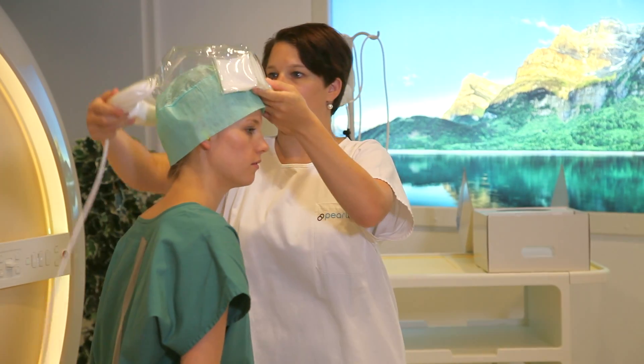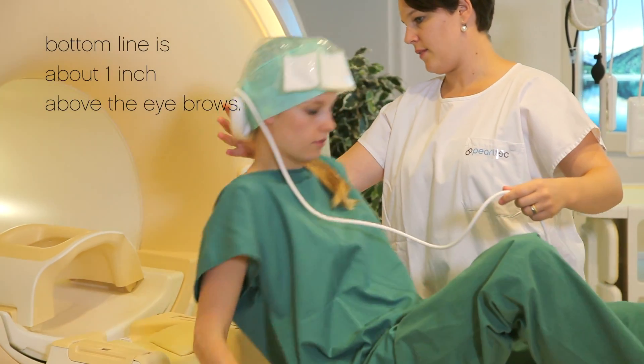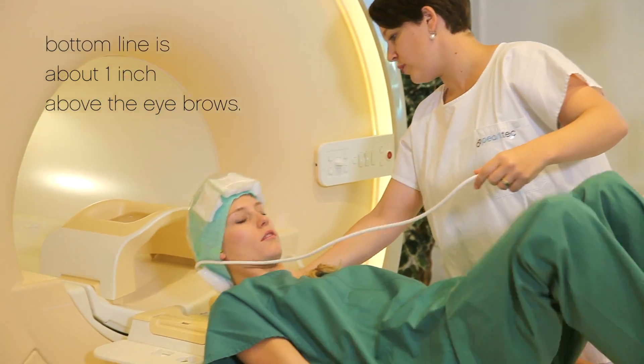Then place the crania over the cover. It's as simple as wearing a cap. Now the patient can lie on the couch with their head placed correctly in the coil.